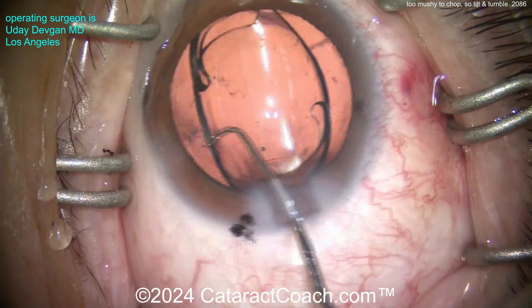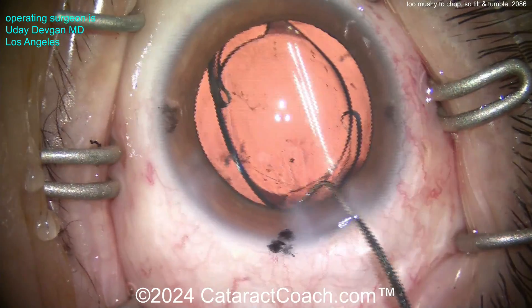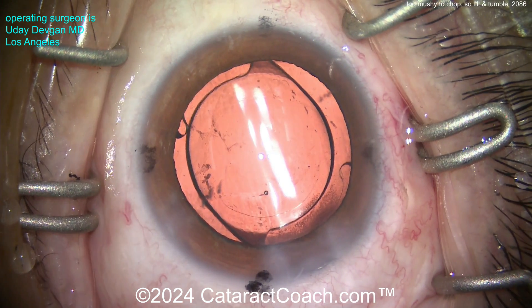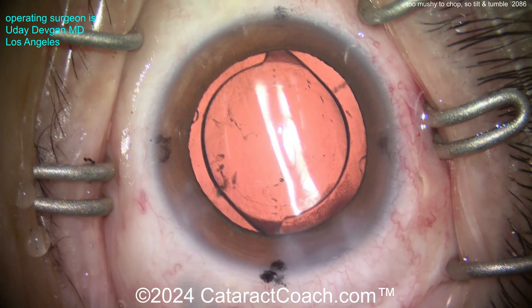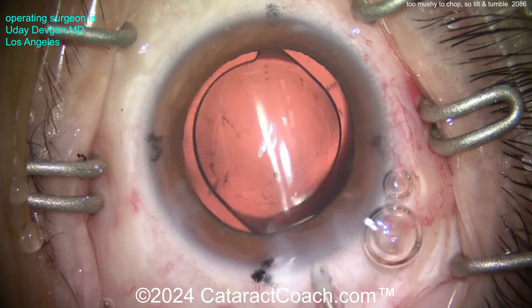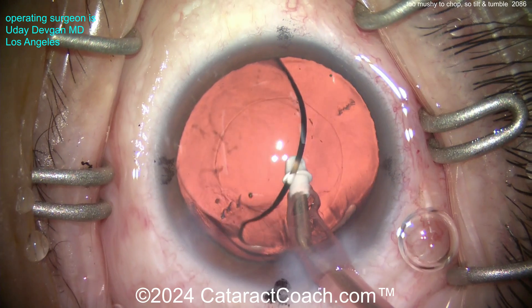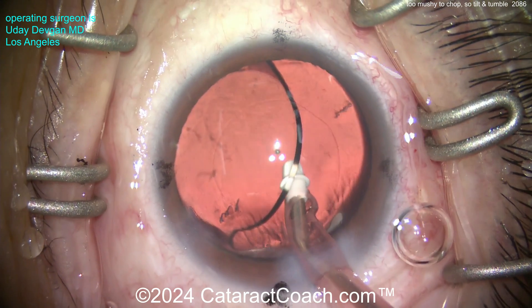So again, this is tilt and tumble. Using the chopper to do a little more polishing of the capsular rim - you can just scrape off those undersurface cells with the chopper. That looks pretty darn clean. Let's take out the viscoelastic and see how clean we got it, then get this lens lined up at the correct meridian.